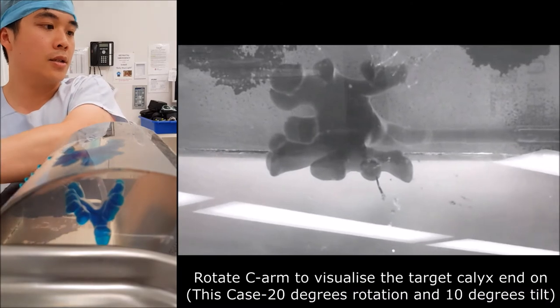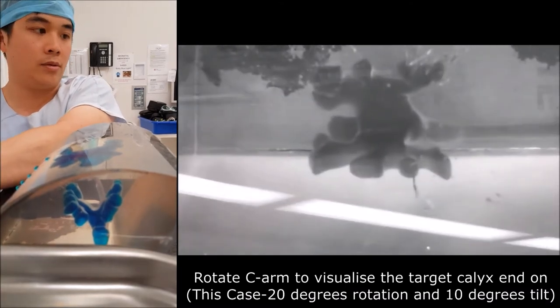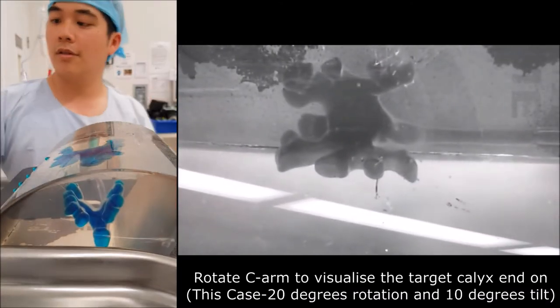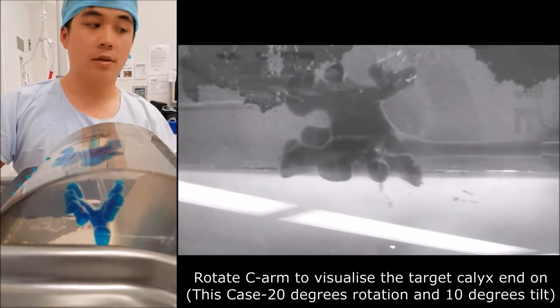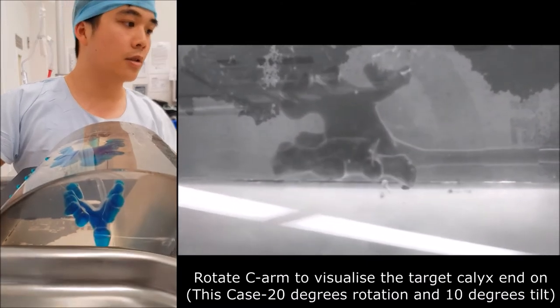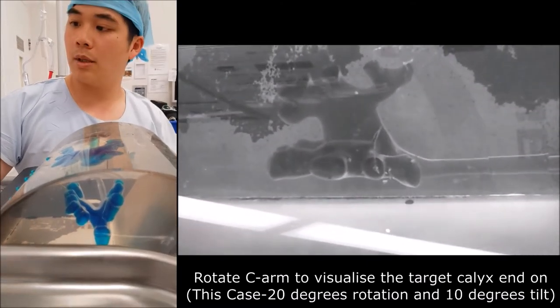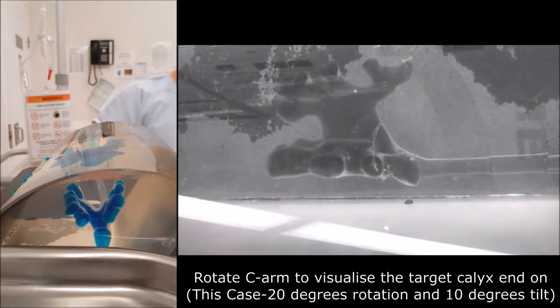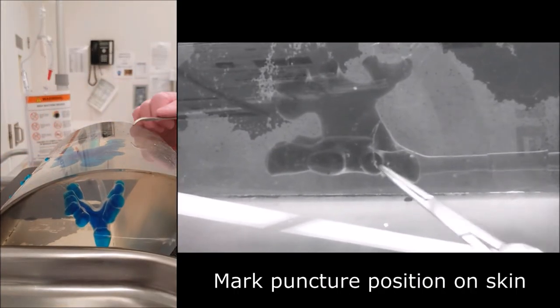The C-arm of the image intensifier needs to then be rotated so that the target calyx is end-on to the image intensifier. In this case, we had to rotate the C-arm to 20 degrees with 10 degrees of tilt.